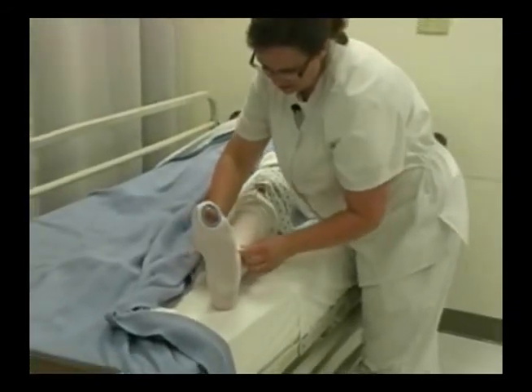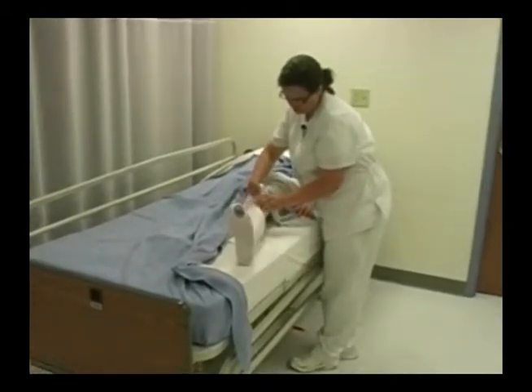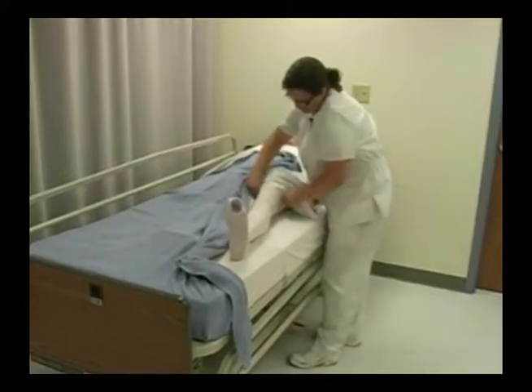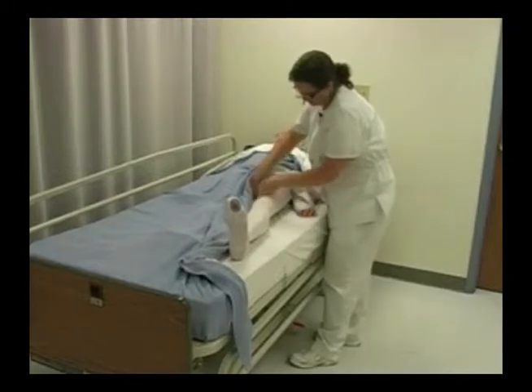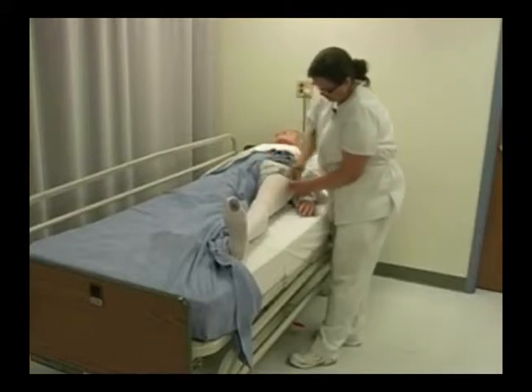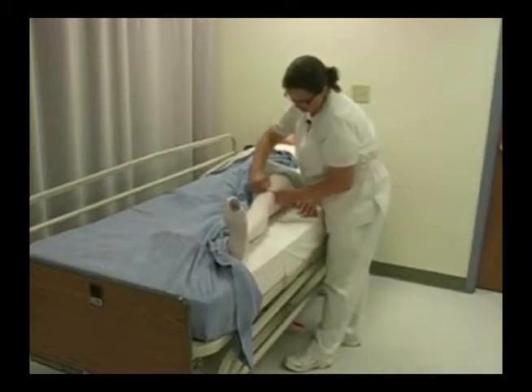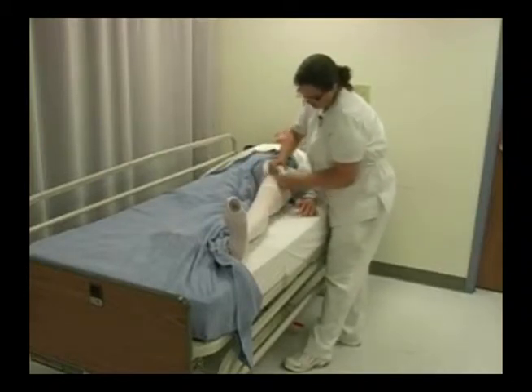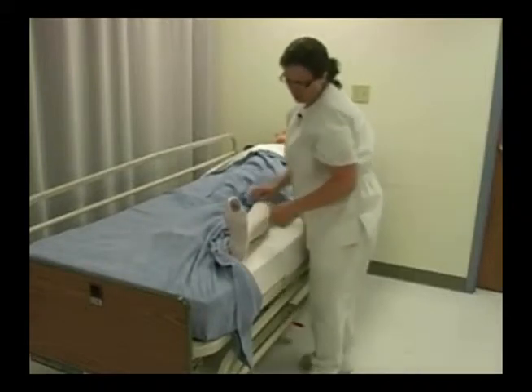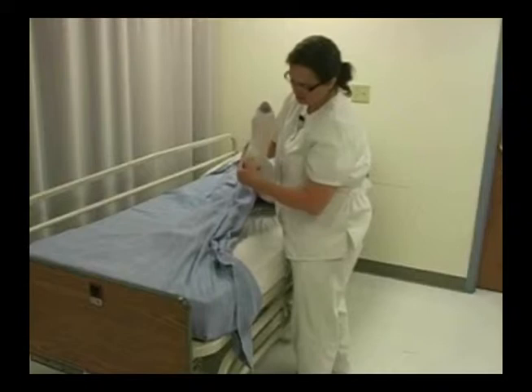When you place a support stocking on your patient, you need to be careful that there aren't any wrinkles and that the stocking ends up in the proper place. Right here on my patient's inner thigh — the seam goes right here. I do not want to have any wrinkles in my stocking. I need to double-check the heel pocket; it should be right over their heel.